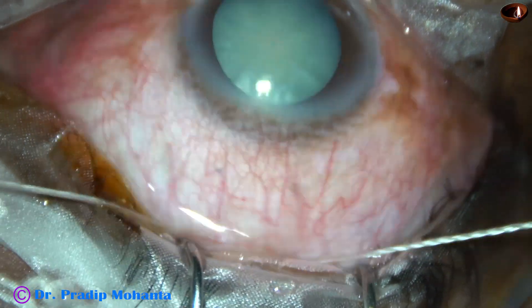An air bubble is injected to keep the AC formed. Now I am hydrating the corneal stroma on either side of the side ports to close the side ports.